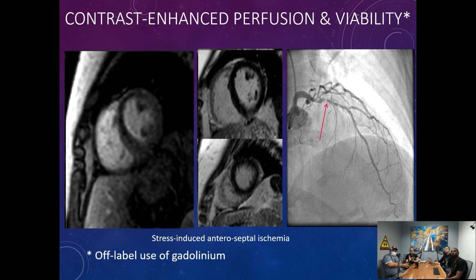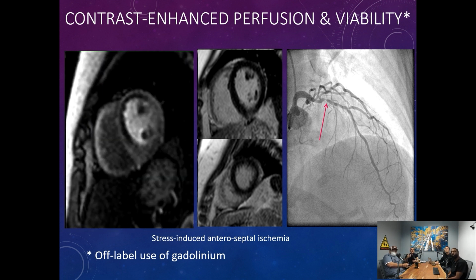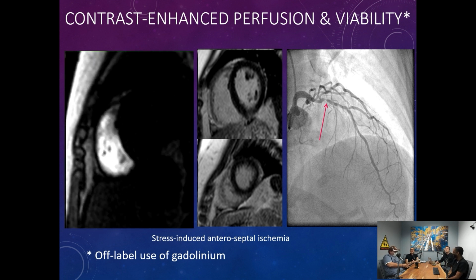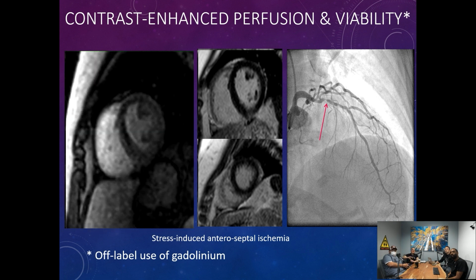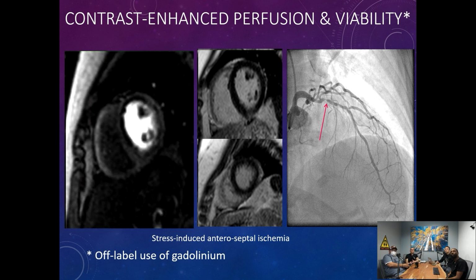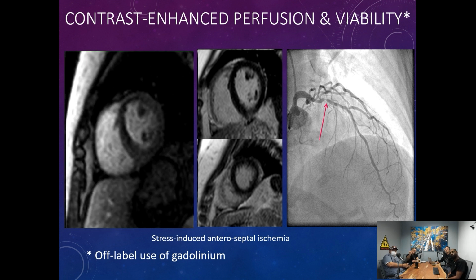Gadolinium really was mainly engineered as an angiographic agent. However, some very intelligent and very observant radiologists, and probably cardiologists, in the early 1990s found that not only would you be able to opacify the cardiac cavities and the great vessels to do great angiography, you also could see the hue of gadolinium, this sort of graying that you see.